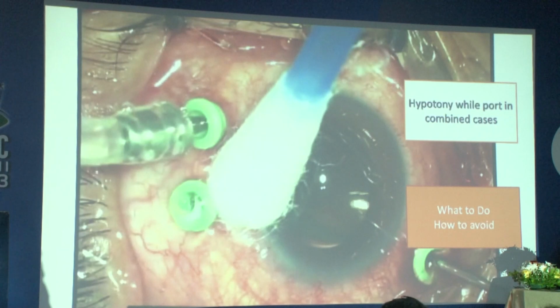Any preferences of the surgeon doing a superior versus temporal approach? Yeah, for me, astigmatism is not an issue in diabetic vitrectomy. If I get to CF 2 meters or 6/60, but I do my own phacos, it's always superior, and I don't have any issue. And obviously, suturing the main port is always recommended if there is any doubt. But overall, I would prefer a superior.